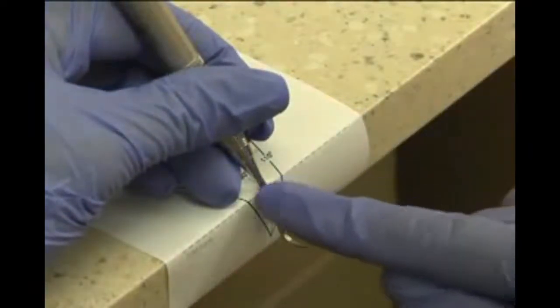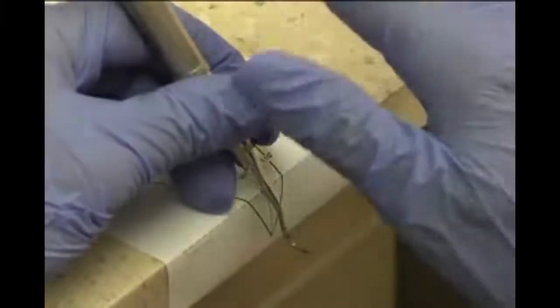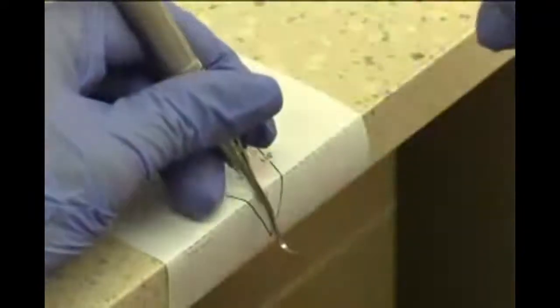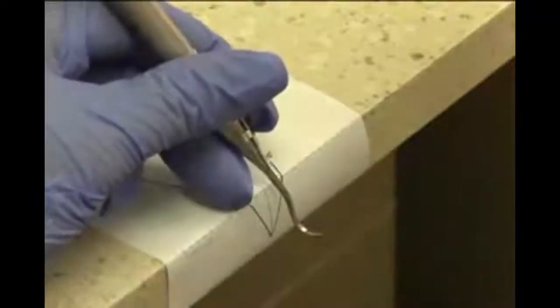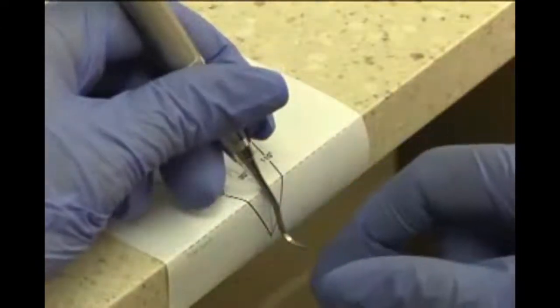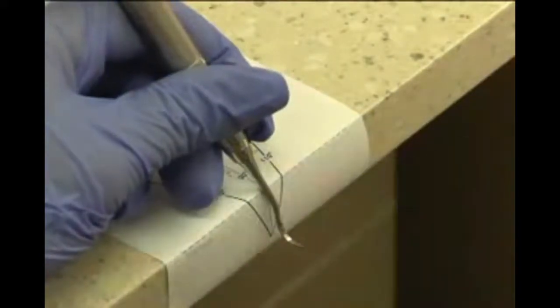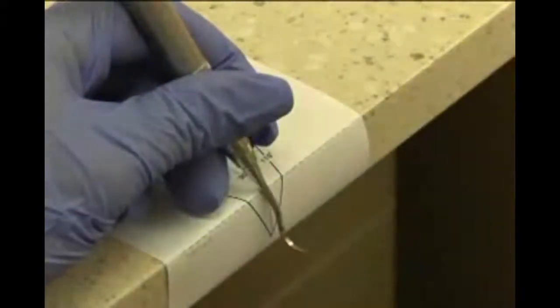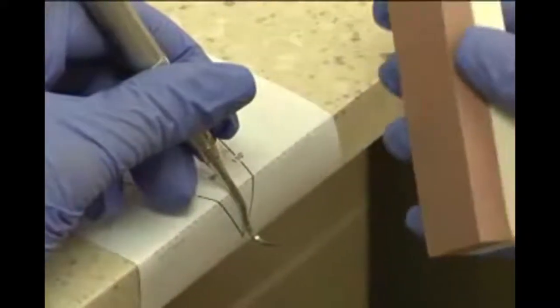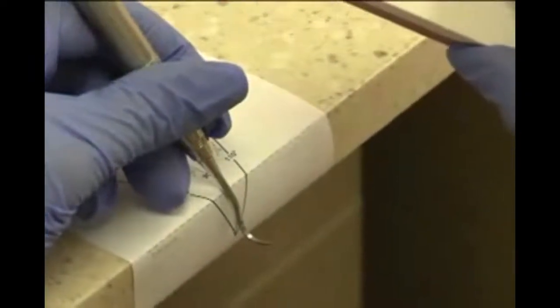I'm also resting my instrument on the countertop. And I don't have what I call the death grip, because I see so many people who hold everything so tight that it makes the whole sharpening process very exhausting. So just hold it nicely, but you want to apply pressure here so you're stabilizing the instrument. Again, my arm is resting. I'm going to use the Edge 2, which is the coarse side on one side and the fine medium on the other side.